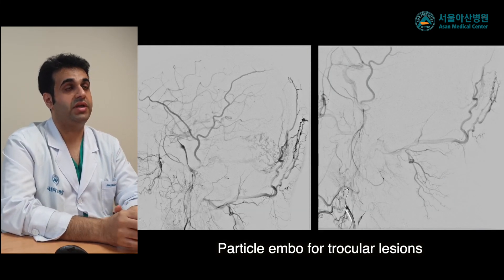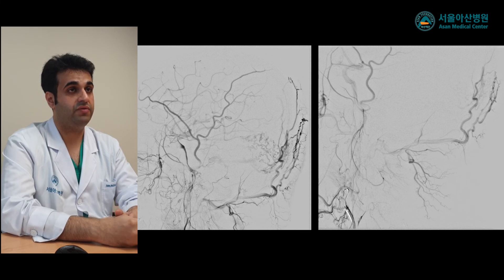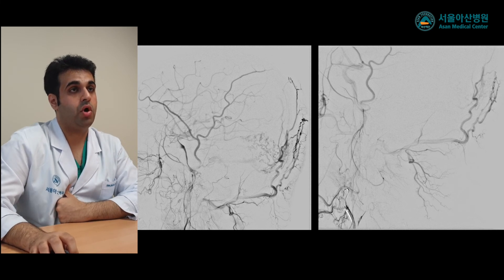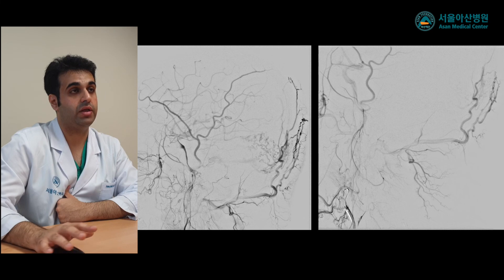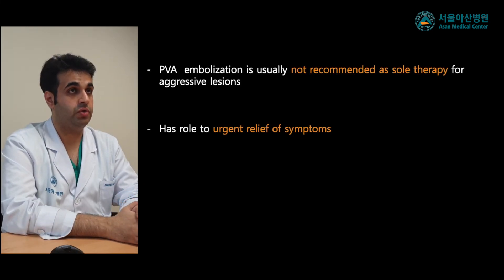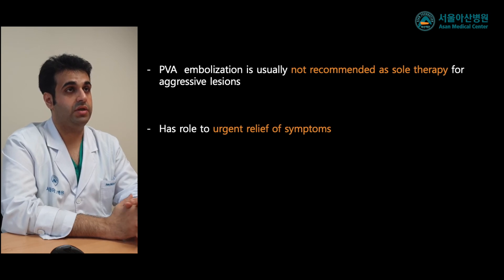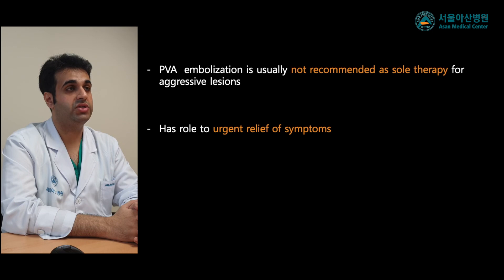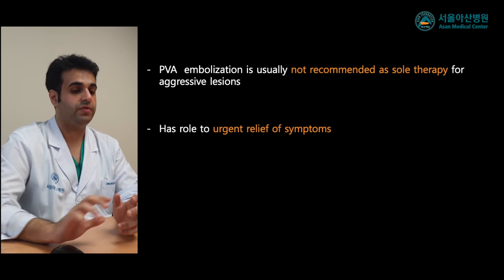The last step was transarterial particle embolization of the torcular dural AV fistula using PVA particles to reduce the shunt flow. However, permanent cure is difficult to achieve with this method alone, and PVA embolization is not recommended as sole therapy for aggressive lesions; its role is urgent relief of symptoms.